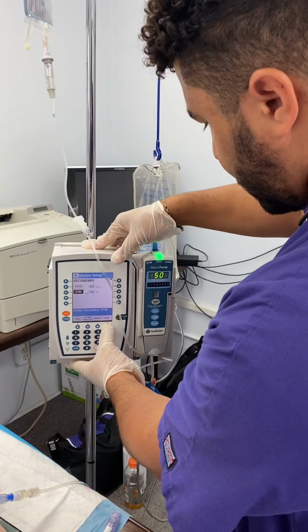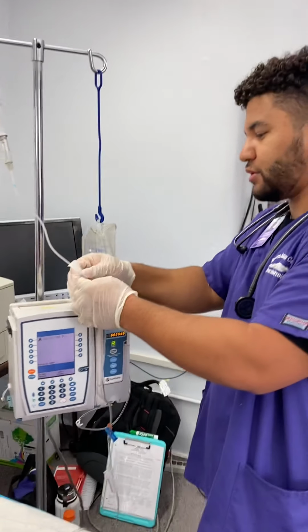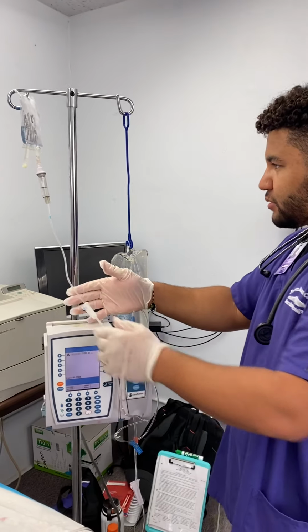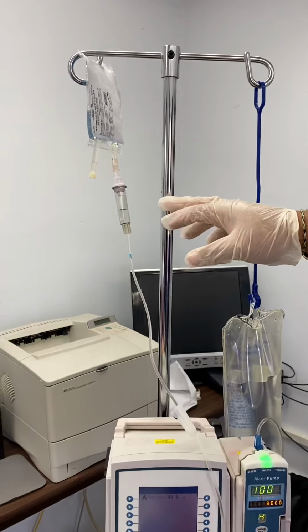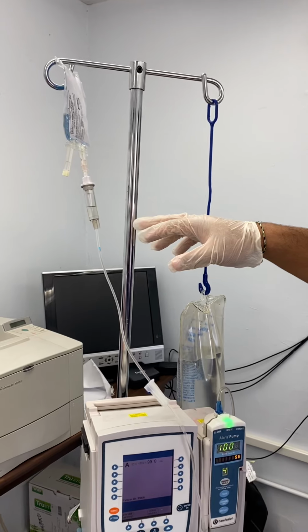All right, and then you can hit start, and you're going to want to make sure that this is unclamped, and you're going to wait for the drop. I'm going to wait for another one just to make sure.